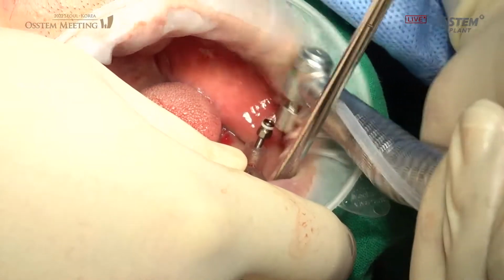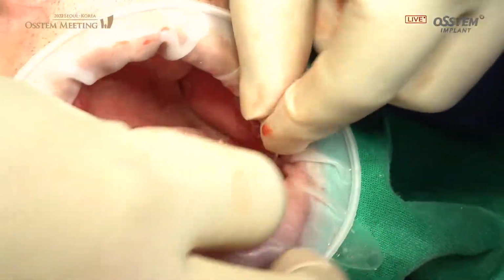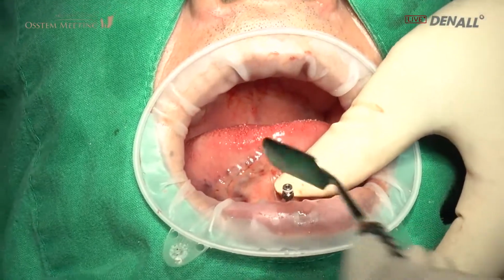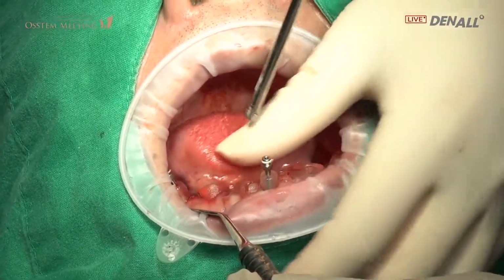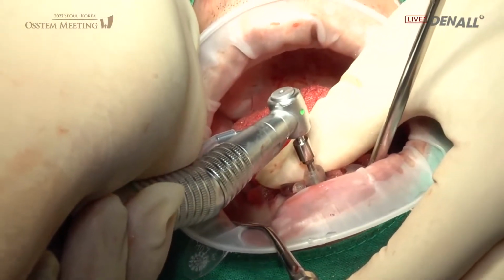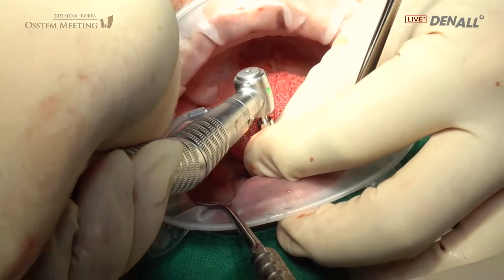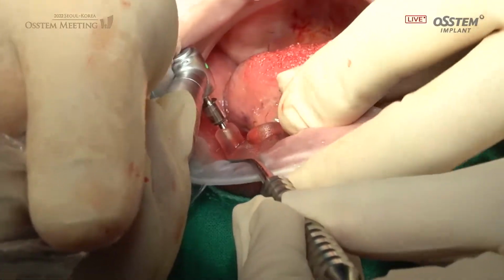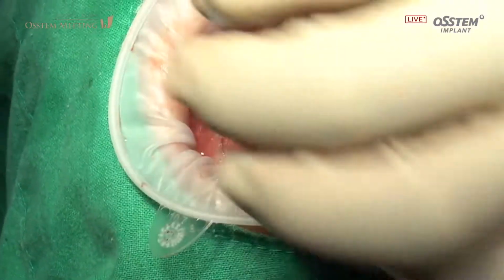The lateral anchor screw is being removed. Please give it to me again. Can you prepare the abutment?